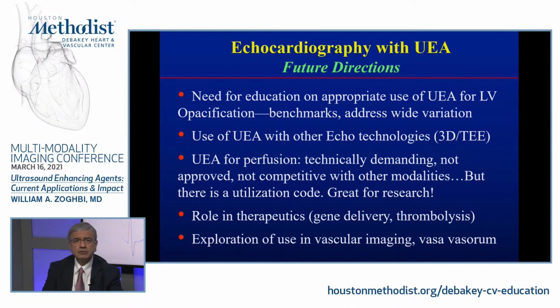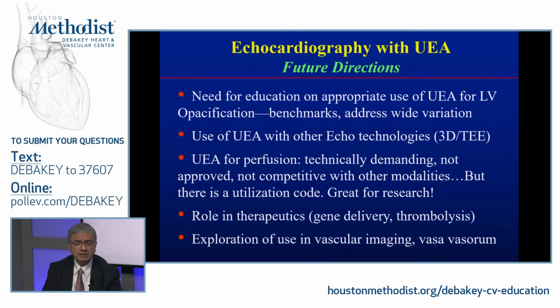We want to make sure that you get the best diagnostic yield out of these ultrasound enhancing agents or out of echocardiography per se. So please use these appropriately, and there are appropriate use criteria and recommendations using the guidelines and the statements from the American Society of Echocardiography. And we appreciate also the various forums, including this one, for spreading the word on how, in addition to where, to use ultrasound enhancing agents in echocardiography, because it will address the wide variation and improve appropriate utilization.